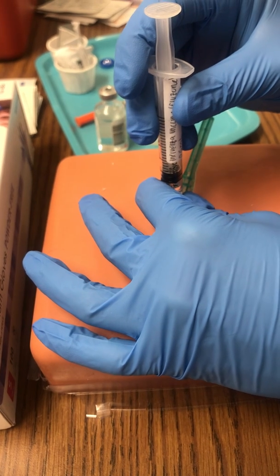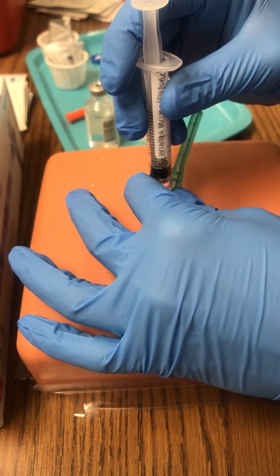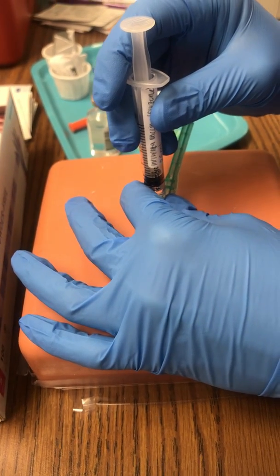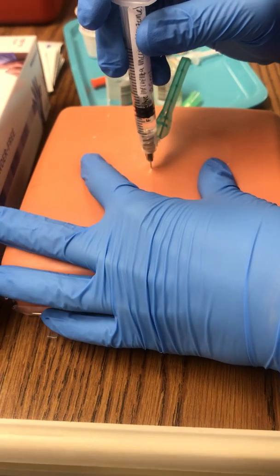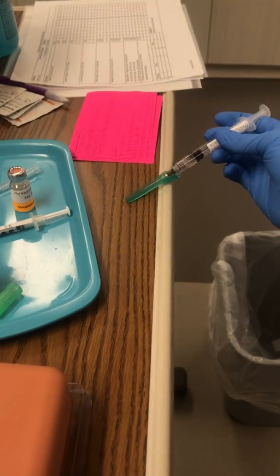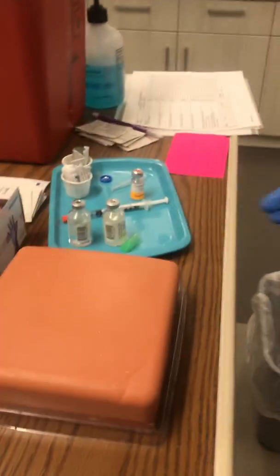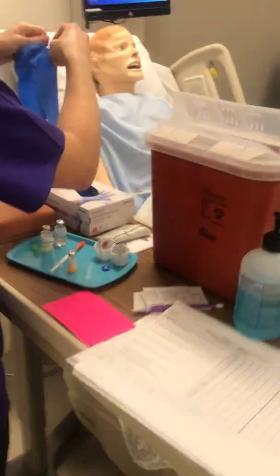1, 2, 3, 4, 5, 6, 7, 8, 9, 10. And then I'm going to stabilize the skin and pull straight out. And then I'm going to put the safety on using this hard surface here, and then put directly into the sharps. And then I'm going to discard my gloves, wash my hands, and then I'm going to put new gloves on.